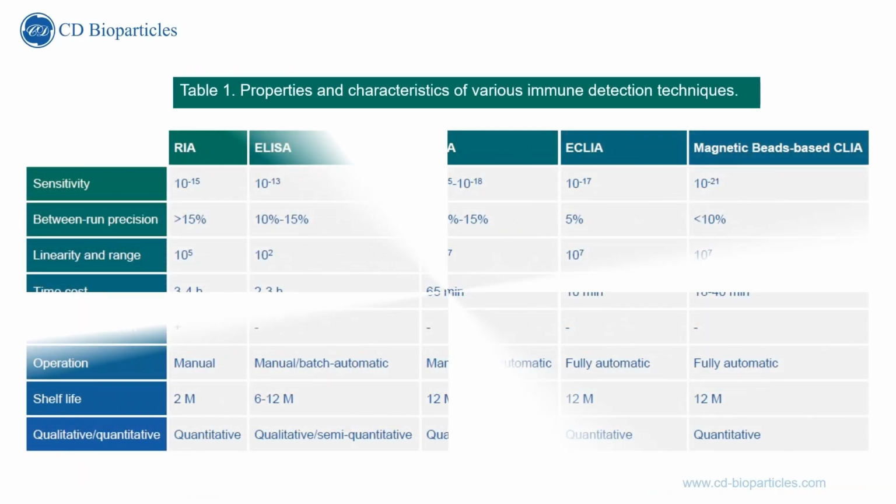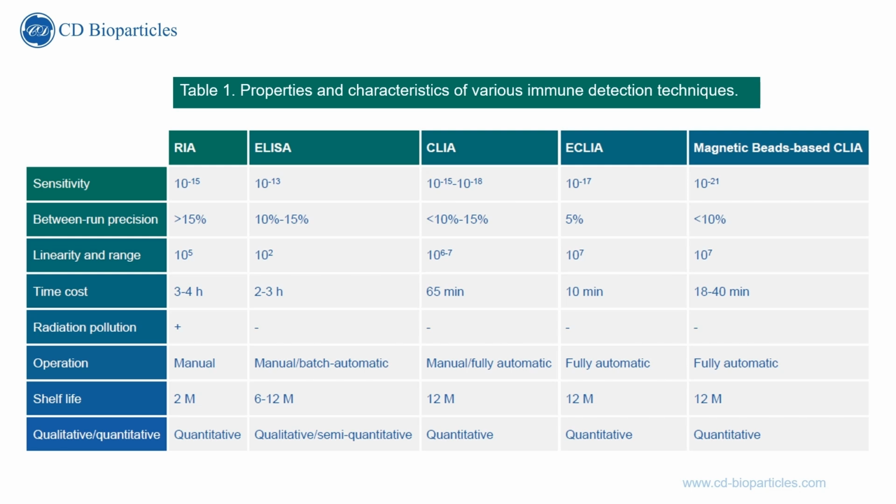Immunoassay is based on the specific reaction between antigen and antibody, and the detection signal is amplified and displayed by isotopes, enzymes, chemiluminescent substances, and so on. It is often used to detect proteins, hormones, and other trace substances. The market offers a range of well-established classical detection methods that are conveniently packaged in kit form. These include radioimmunoassays and enzyme-linked immunosorbent assays. These two detection methods are highly sensitive and suitable for a variety of biological and chemical testing applications.